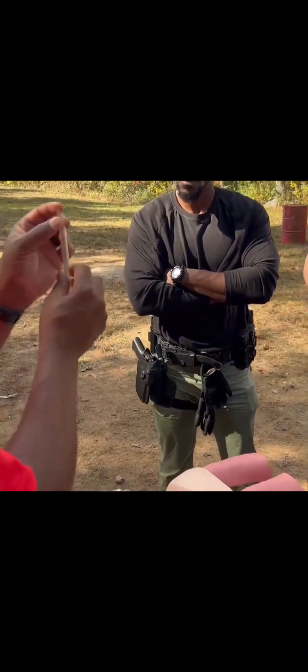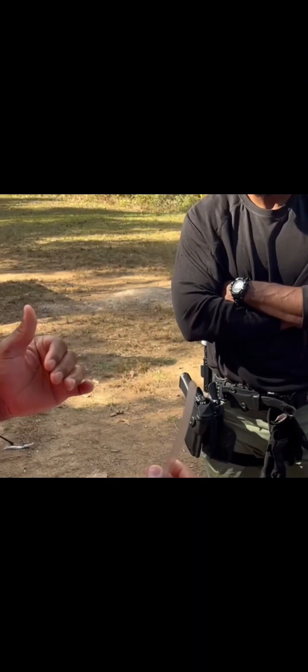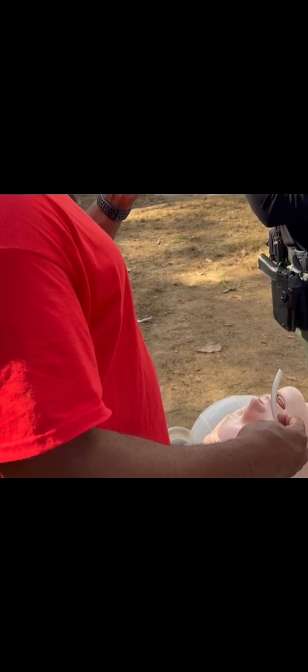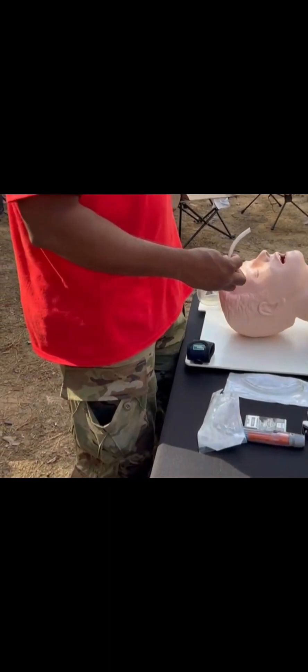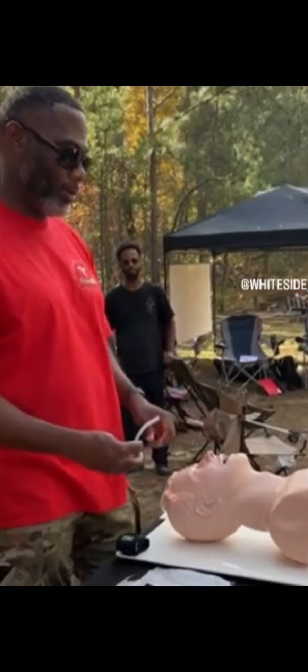You'll see that they have a bevel. The bevel is always to the septum. When they developed these, they realized the right nostril is a little larger than the left, so when you go for it, it's always bevel to septum. The inside of your nose — the septum — is very sensitive, very thin mucosal tissue. If you scratch it, it will bleed very easily. But if you go on the outside, it won't bleed at all. That's why the bevel is open, so it rides against the septum itself.